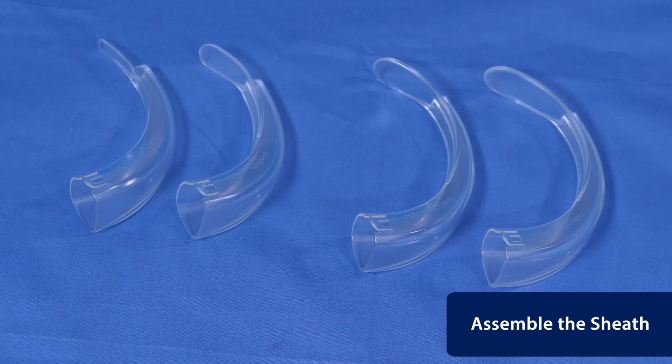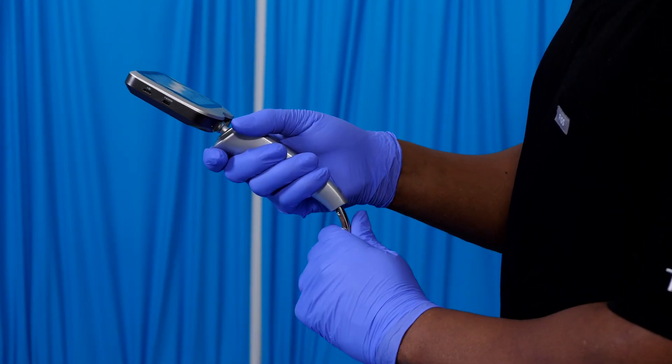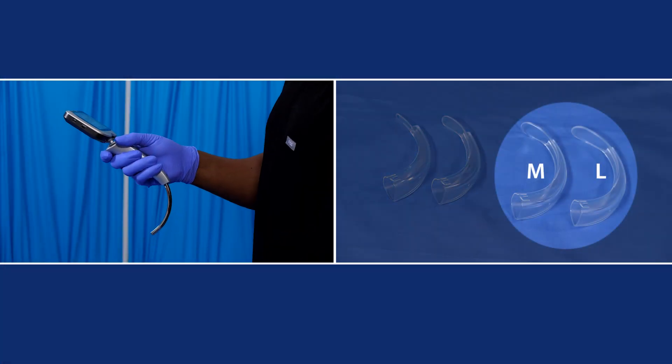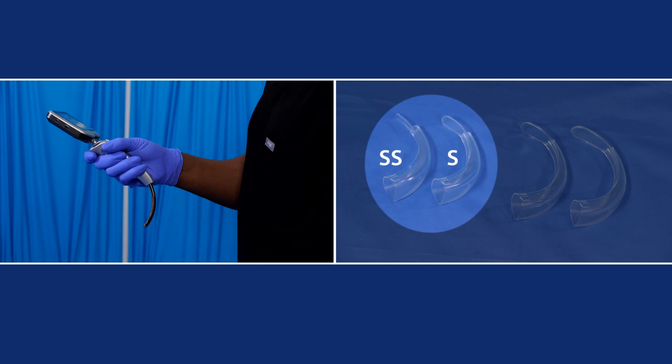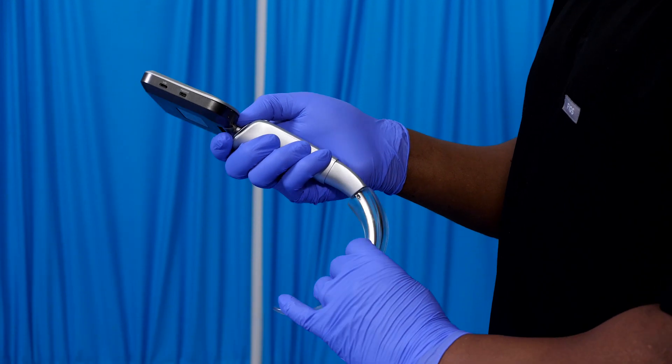Choose the proper size sheath according to the patient's weight. Pull out or push in the slider to ensure it's suitable for the sheath size. The fully extended level is suitable for the M and L sheaths. The short level is suitable for the S and SS sheaths. Insert the sheath onto the handle until it clicks.